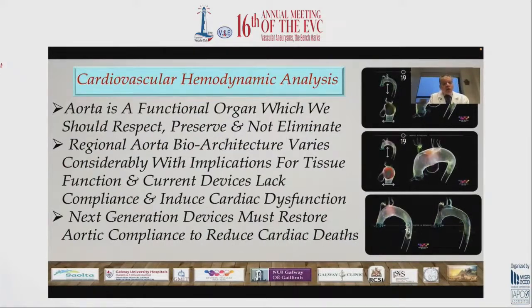The aorta is a functional organ which we should respect, preserve, and not eliminate. Regional aorta bioarchitecture varies considerably, with implications for tissue function, and current devices lack compliance and induce cardiac dysfunction. Next generation devices must restore aortic compliance to reduce cardiac deaths.